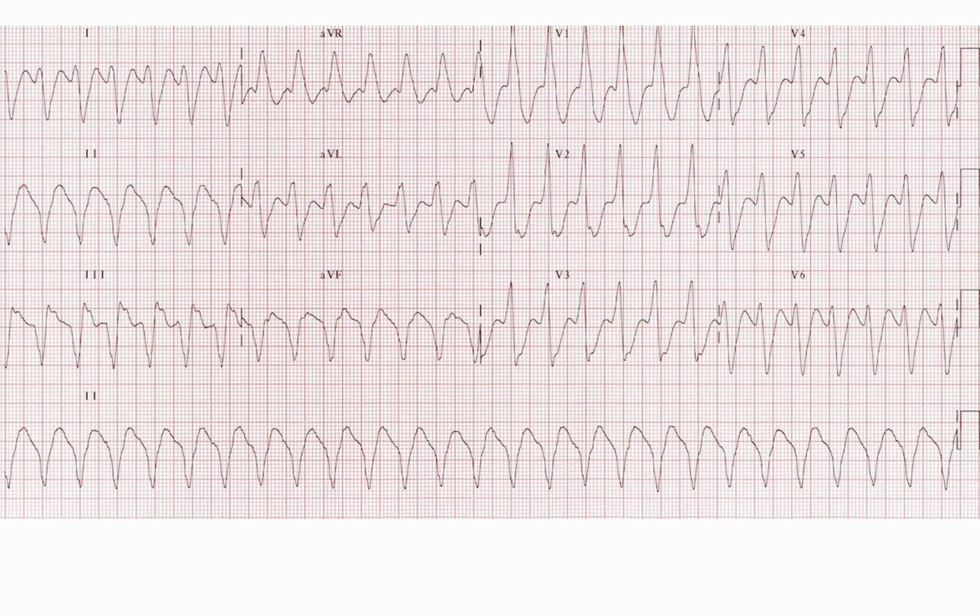Okay, let's talk about it. So we have a wide complex monomorphic rhythm with a rate of about 150 to 160. Thinking about our ventricular activation velocity, we note an RS interval of greater than 100 milliseconds in the precordial leads. We also note a total QRS width that is very long, greater than 200 milliseconds. Finally, we take a look at our morphology.